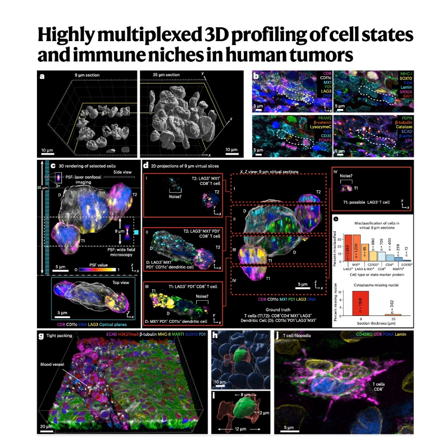They looked kind of round when they were deeper in the tumor, but appeared elongated or stretched out at the invading margin. People thought this was an intrinsic change in cell biology related to invasion. But it wasn't. No. When they looked in 3D, they proved it wasn't a change in the cell's actual shape at all. It was simply a difference in orientation.